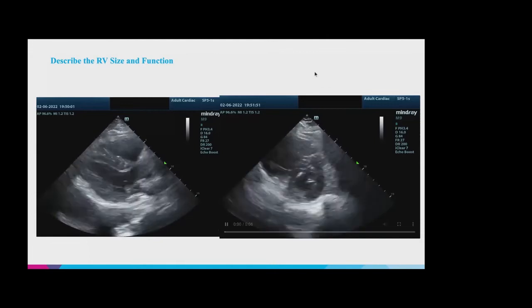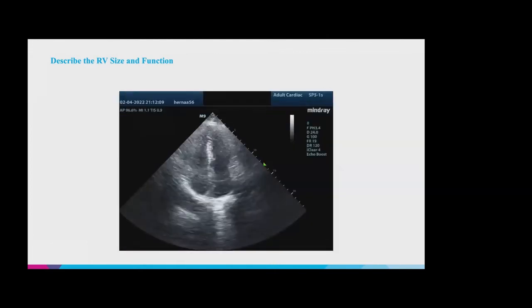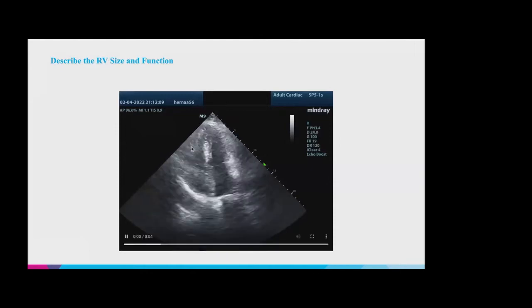And then I think I have, yeah, this is probably the same patient, but unfortunately the apical 4 chamber is not as good, but you have to sort of imagine the free wall being over here, right? So this would be definitely, I would say, at least moderately enlarged, but it's not a view where I would be able to appreciate whether there's McConnell sign or not.